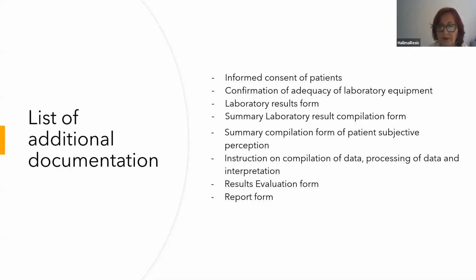Informed consent of patient, confirmation of adequacy of laboratory equipment, laboratory results form, summary laboratory results, summary compilation form of patient subjective perception, instruction of data, processing of data and interpretation, results evaluation, and report form.